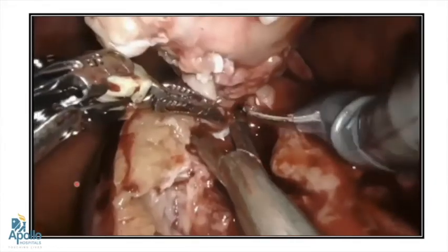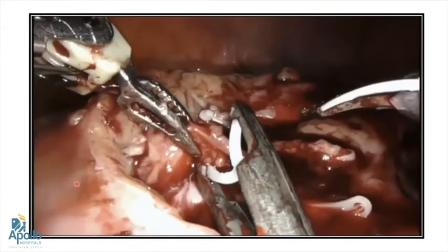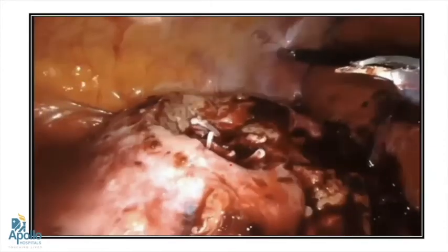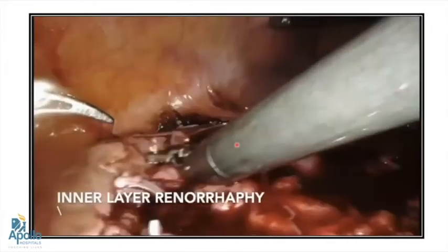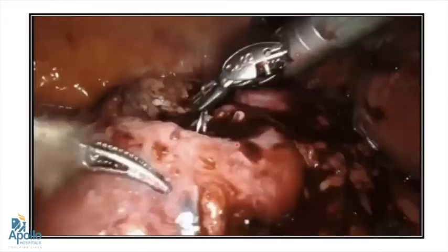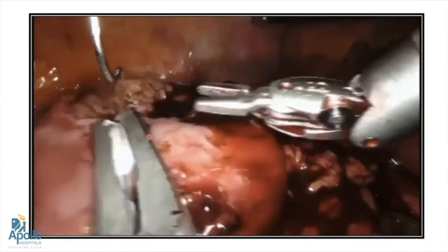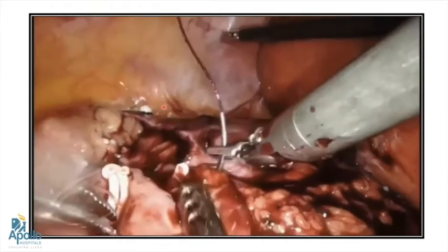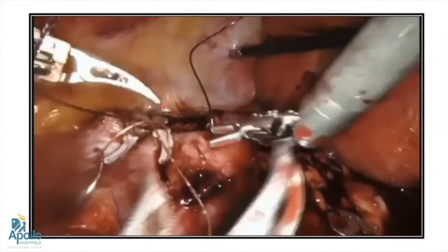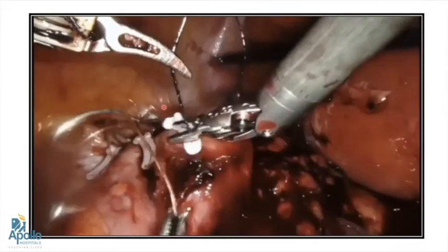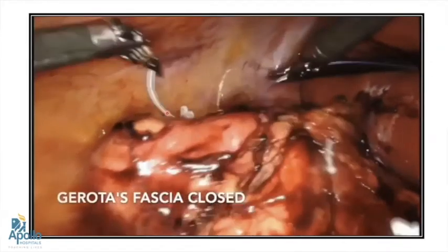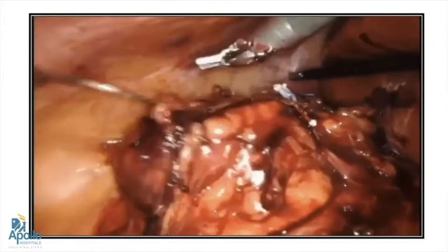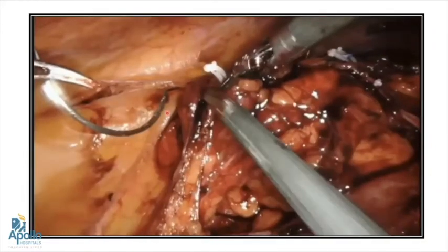Once the tumor is resected, any visible small vessels are individually clipped. The renorrhaphy is started using 3-0 Stratafix for the inner layer in a continuous manner. Any opening of the PCS system is separately sutured. The outer renorrhaphy is then done — in this early case, interrupted sutures were used. After completion, the vascular clamps are removed and hemostasis is observed for five minutes before closing the Gerota over the kidney.